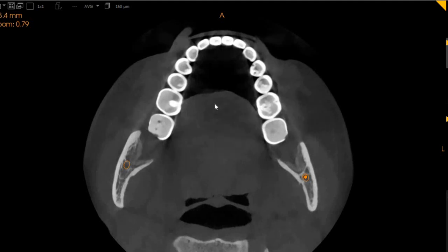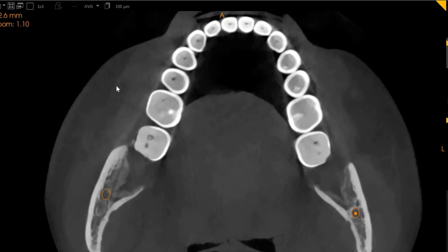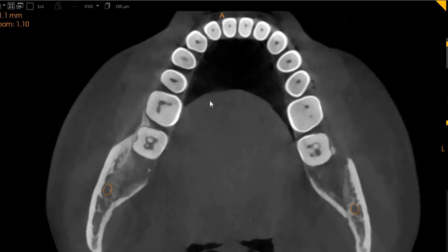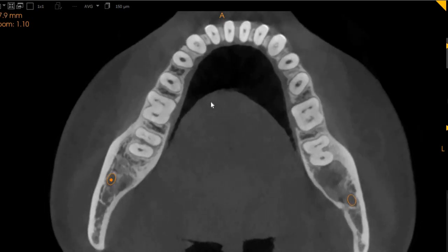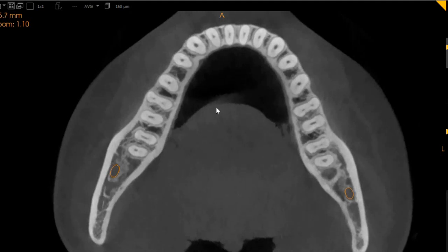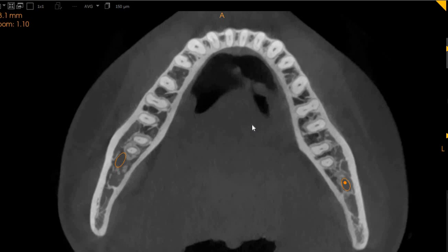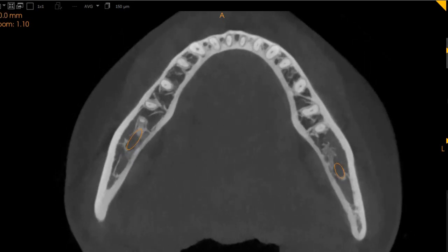This is the axial or top quarter view. If you go slightly further down, you'll be able to see that both these 6s don't show any major signs of pathologies or periapical radiolucencies. You've got two canals in the mesial and one canal in the distal. Nothing very significantly problematic, but we will do an individual assessment of each tooth, starting with the lower left 6.